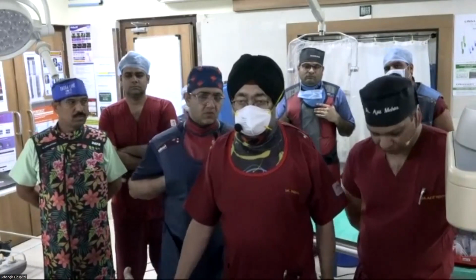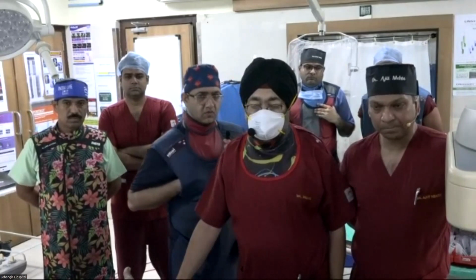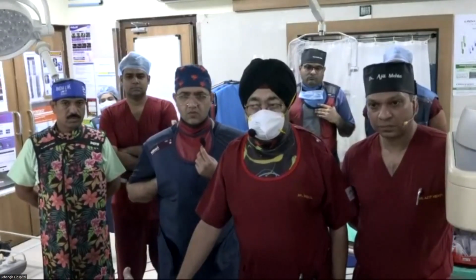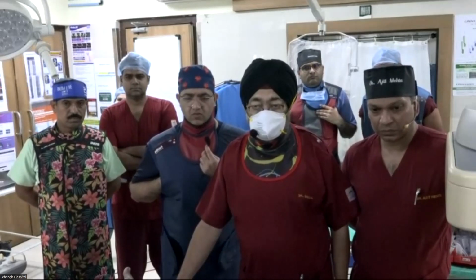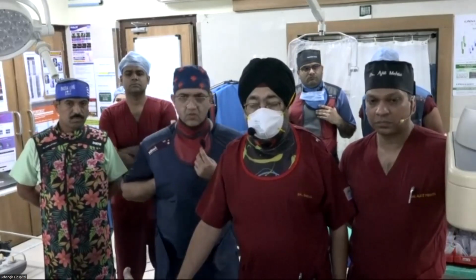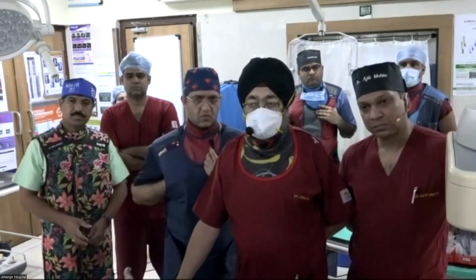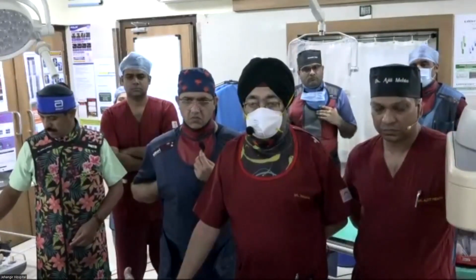And so the reality is that if you present more frequently with an ACS compared to stable, you're going to have a higher rate of events later. So while we like to ascribe it to the nodule itself, it might just be the protoplasm of the patient. I think similarly, the question of IVL versus an NC balloon, the IVL data on nodules is all observational only without a control arm. We have no idea what the natural history of it would be if you did something else, exactly like what you did, which was rotoblator, if you did an NC balloon, if you did a cutting balloon. So it's just a big caution you have to take when analyzing the data. It's not to say it doesn't work. It's just make sure you're a little bit more circumspect about the conclusions.